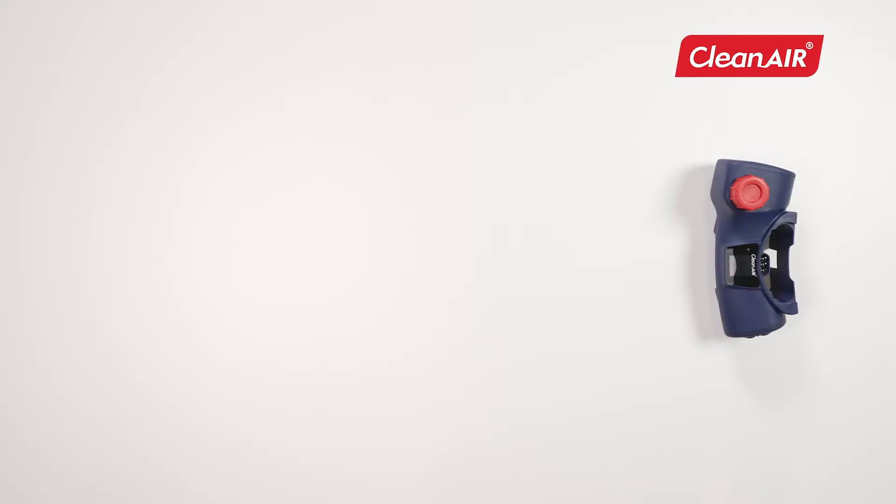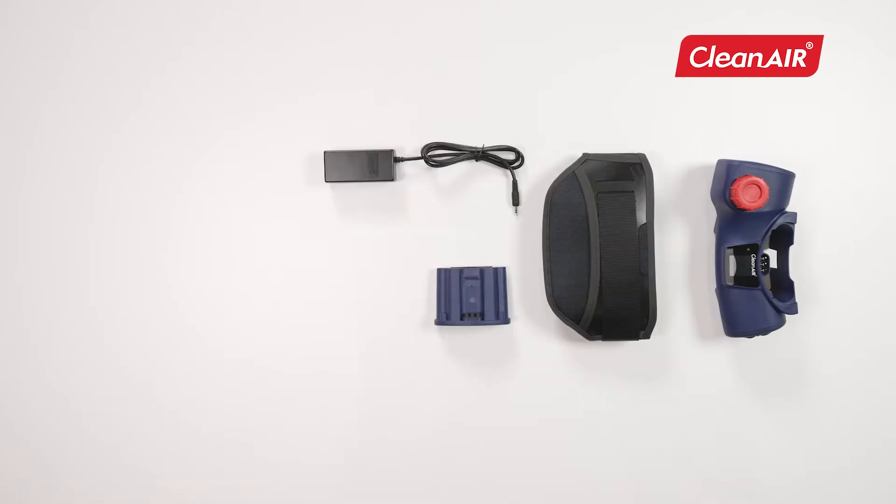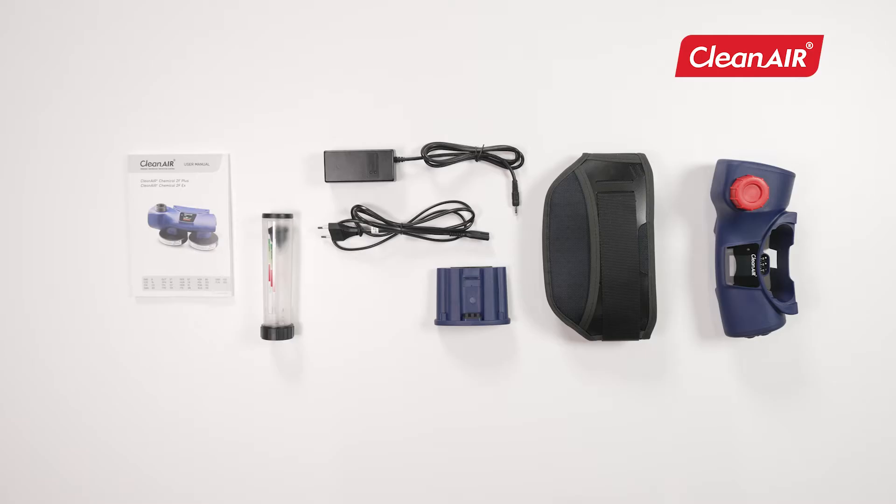The package includes a powered air purifying respirator, particle filters, filter caps with spark arrestor, belt, accumulator, charger, airflow meter, and user manual. The contents of the package may change according to the specifications.